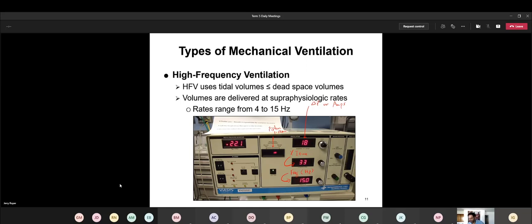And then over here, of course, these are the knobs that control. And then over here, we've got a category that says mean pressure. You notice how they've got things sectioned off. That's why I started here and then I jumped over here. I was going to save alarms to last anyway. So they've got their own little sections on the panel. Now we're at the mean pressure. It says limit, and it goes from about 10 to 45. There are no values printed on the panel itself. It just says min and then max on this side.